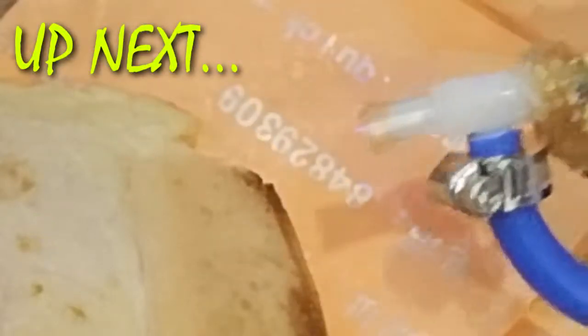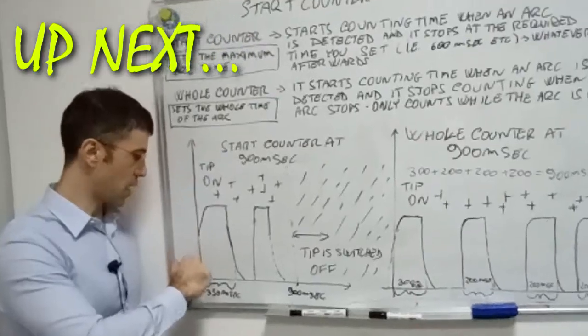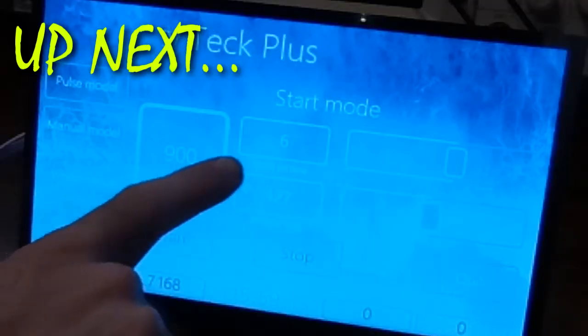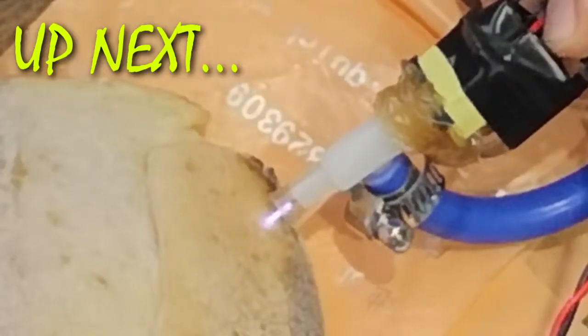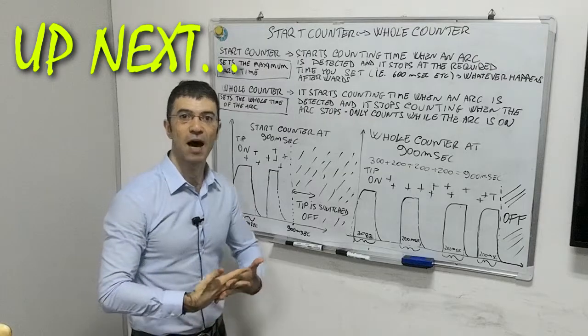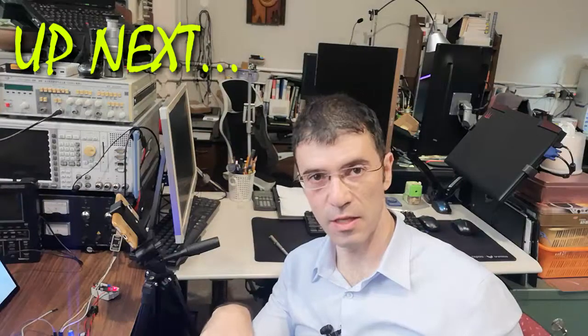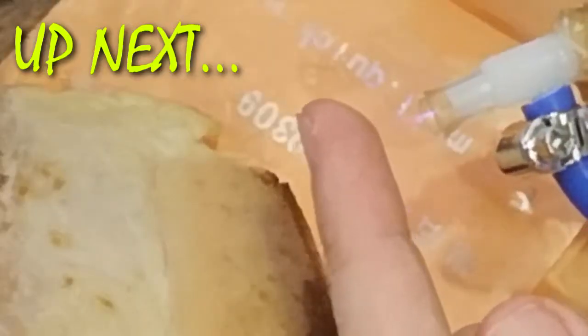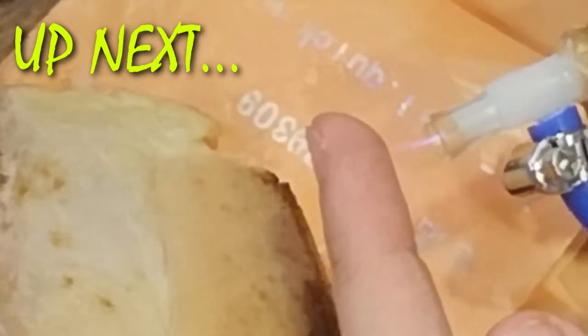Then a tiny bit is still on, then another. Because I want to draw your attention to the transients. So for 900 milliseconds, and then wait 6 seconds. The maximum arcing time function, the cold plasma, because we've got this prototype. Even if there's an arc, it's not detecting it properly.